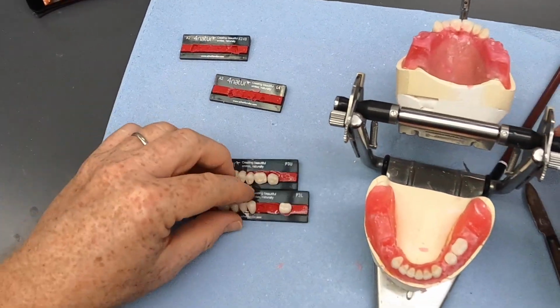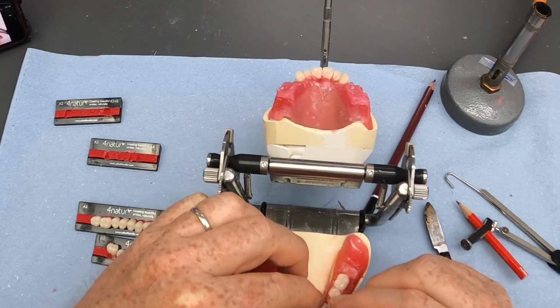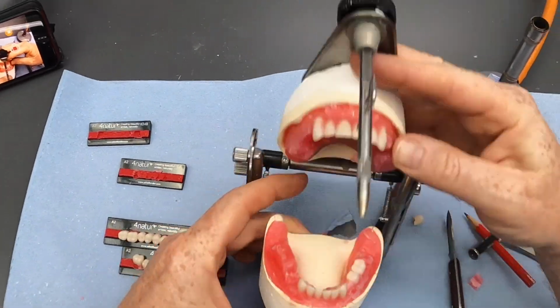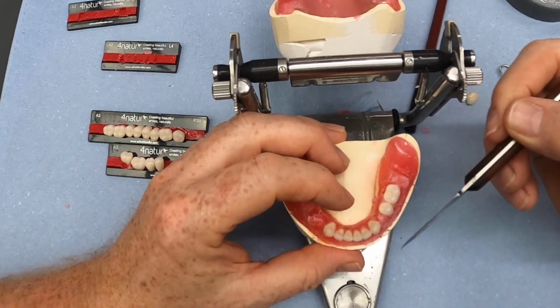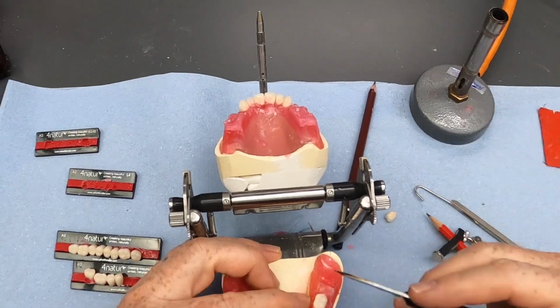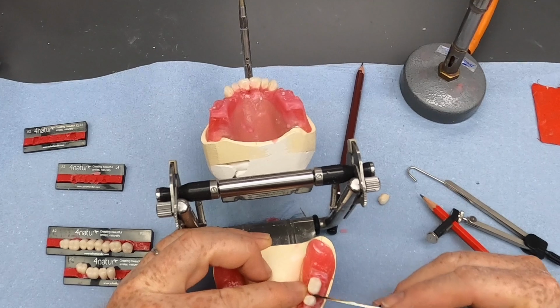Now you can see we've got a small gap for the 4. So I don't think we're going to get that in. Let's just see how we're getting on with the canine. I might just pop that canine out a touch wider in the arch so that I can create a little bit of space for the 4, and also squeak this molar tooth back just a touch.